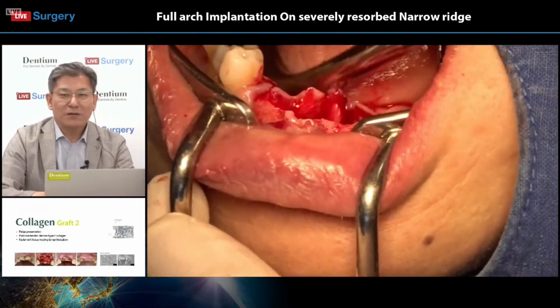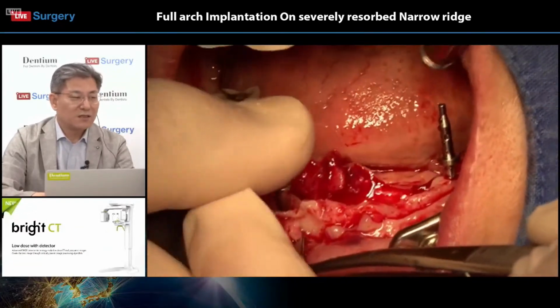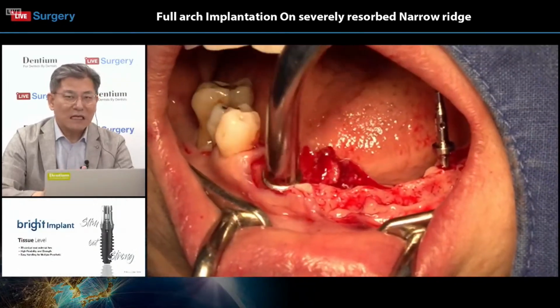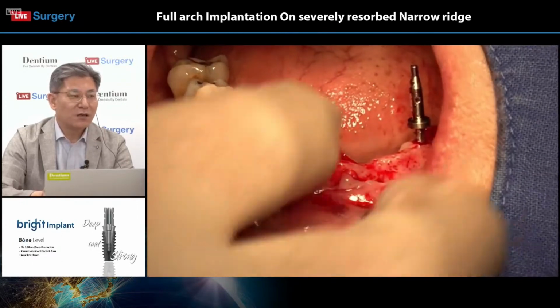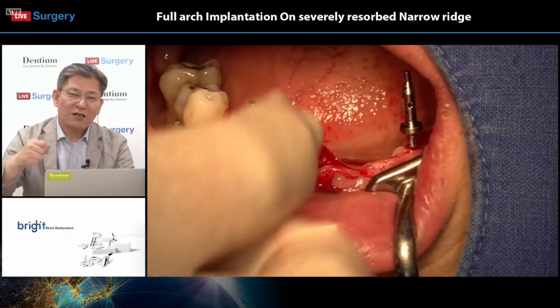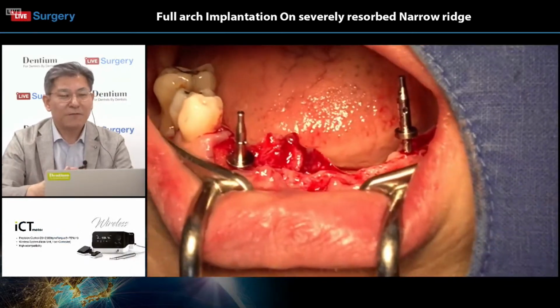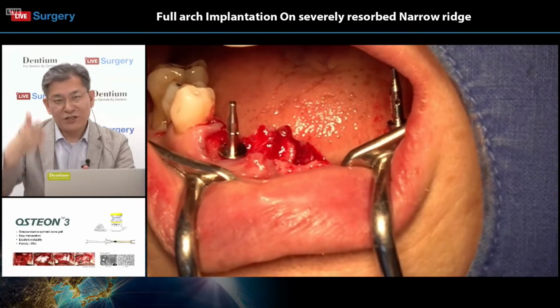For the convenience of the patient and the surgeon, we have to get the maximum insertion torque when you have osteotomy and implant insertion. So first, the drilling exercise is very important: undersized drilling, lateral cutting or oblique ridge drilling.